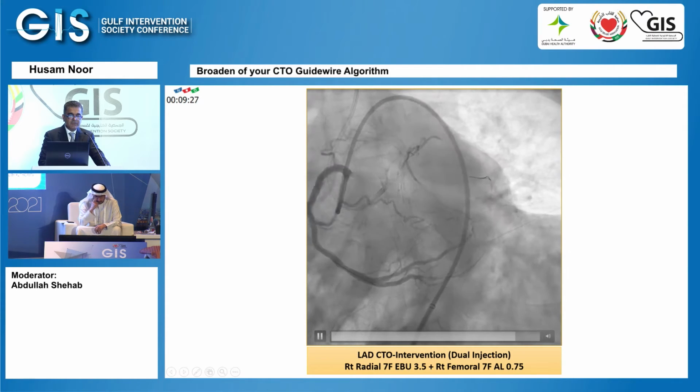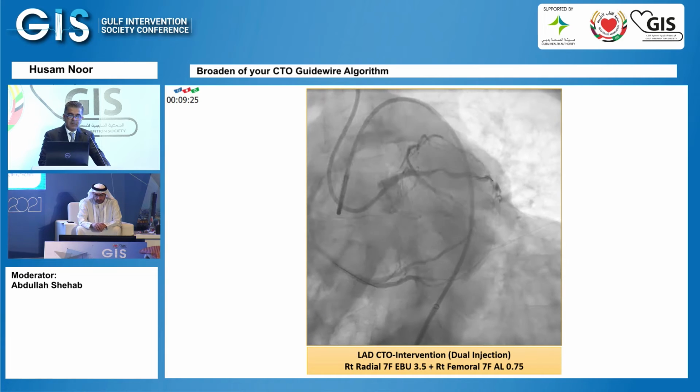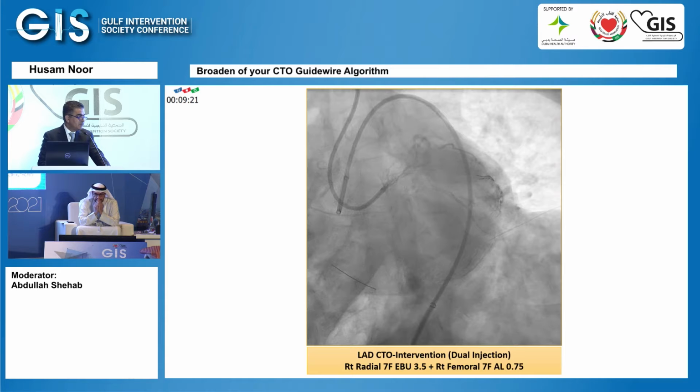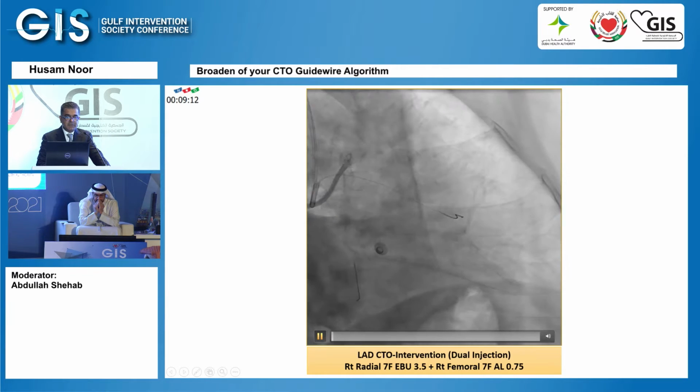So multiple views, no panning. It's very, very important not to pan, and you sit down and really analyze the anatomy, and spend time trying to analyze in very much detail, because that's going to help you in planning your procedure.